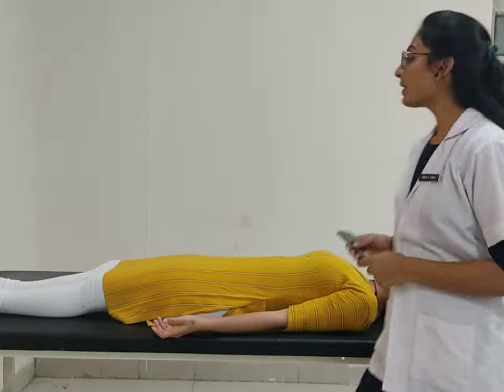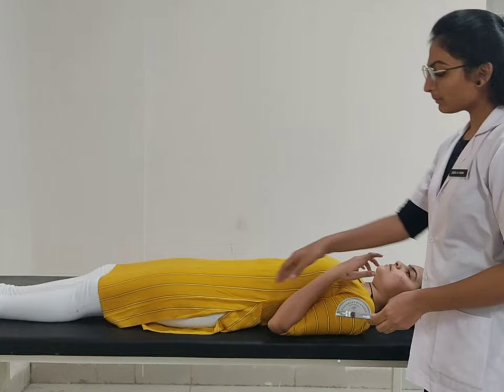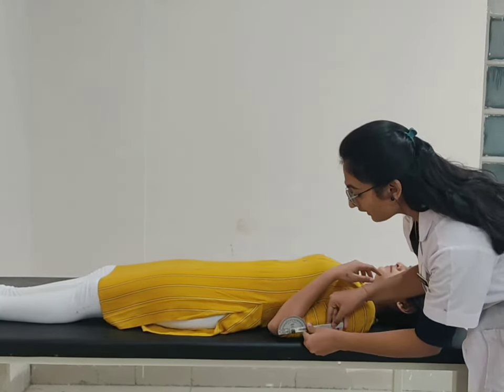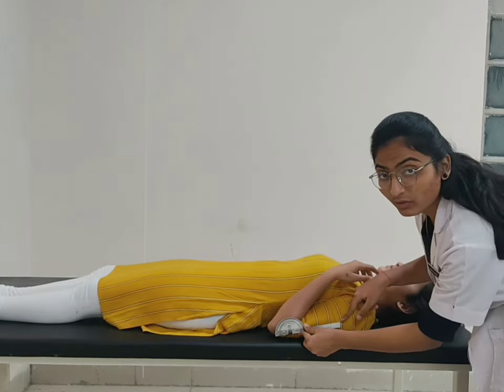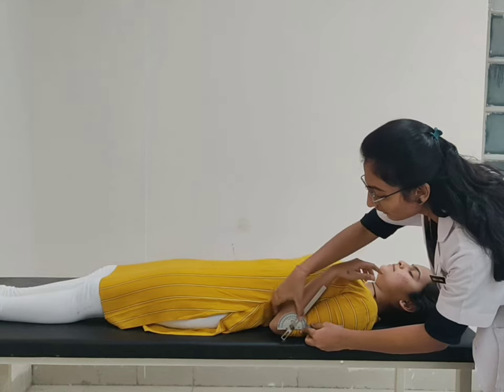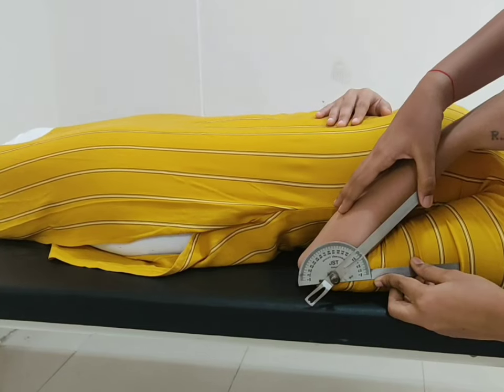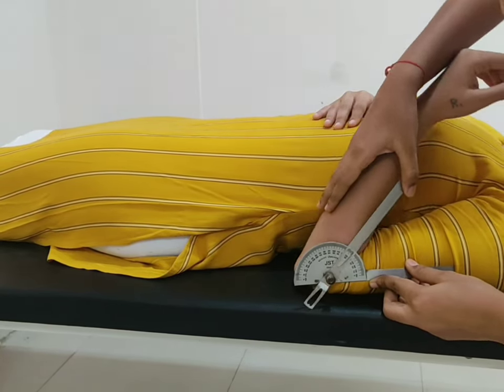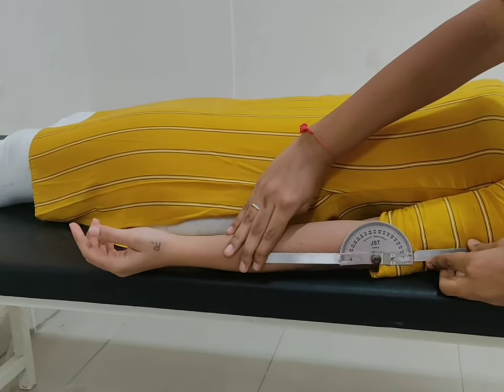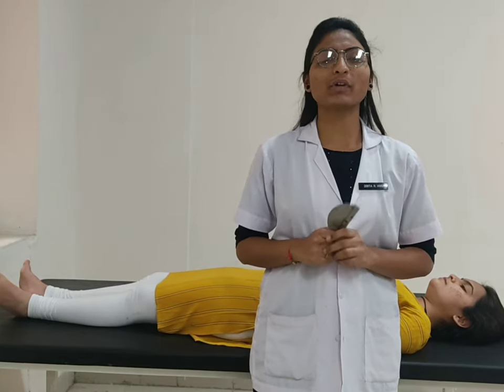For elbow extension, patient position supine with elbow in flexion. Fulcrum placed over the lateral epicondyle of the humerus. Stable arm placed over the mid-line of the lateral aspect of the arm. Ask the patient to straighten your arm. Normal range of motion for elbow extension is 145 to 0 degrees.